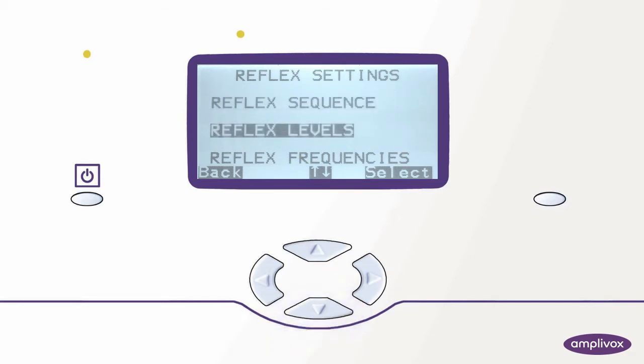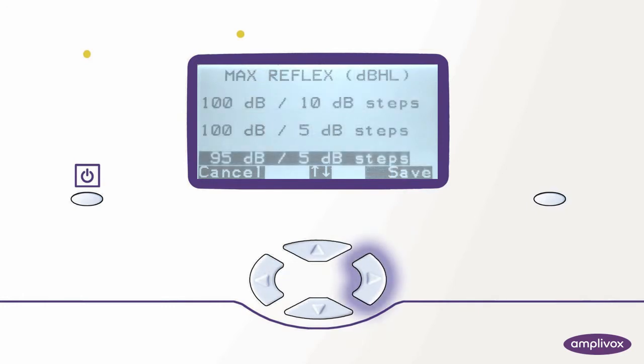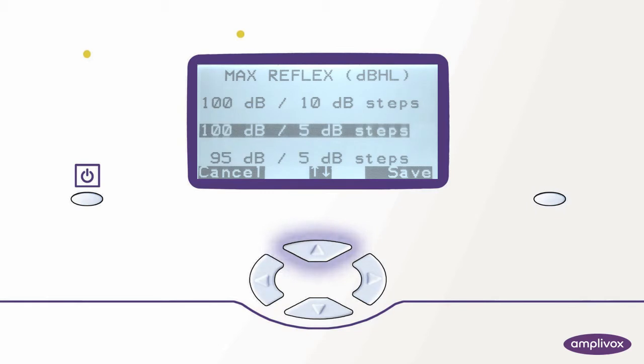The next step is to define the reflex levels at which we test. As we only test ipsilateral we press the right key again. We can see our current test setting is set to 95 dB. We would prefer to test up to 100 dB in 5 dB steps so we select the up key to highlight our preferred setting and save.